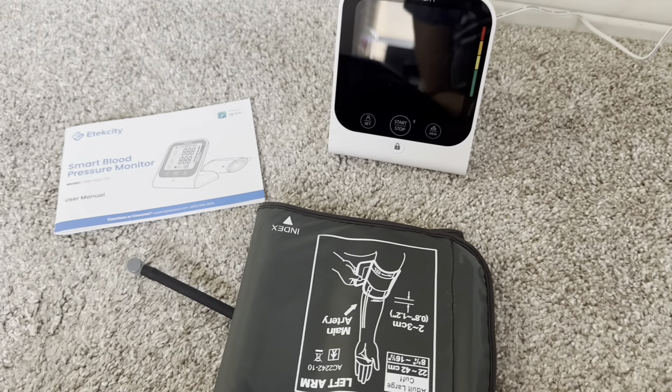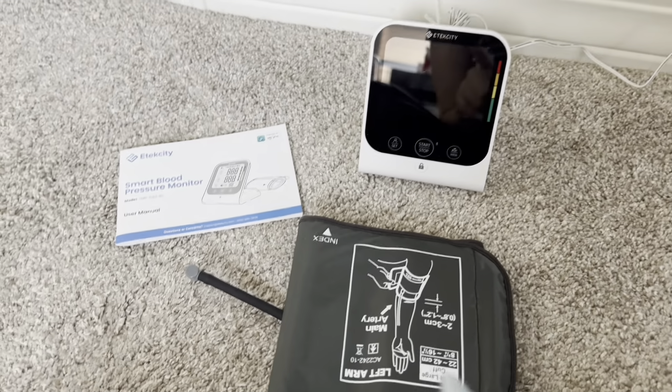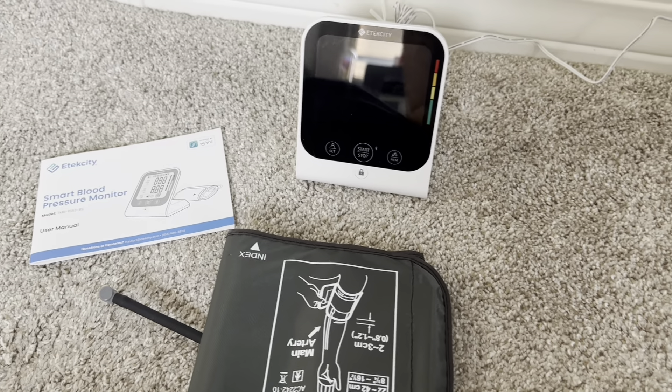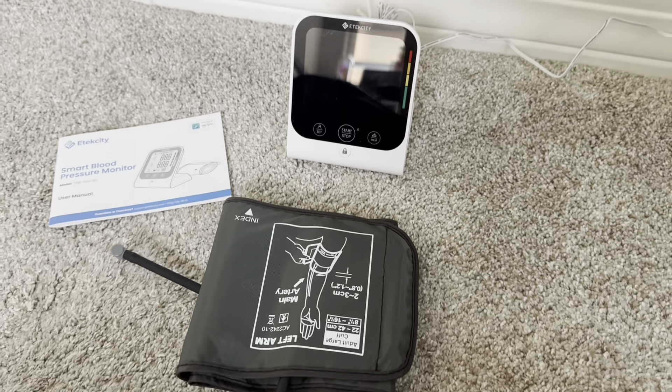I wanted to do a quick check back in. I've actually been using this monitor for about a year and a half now and it is still working wonderfully, still giving accurate readings, still super easy to use.